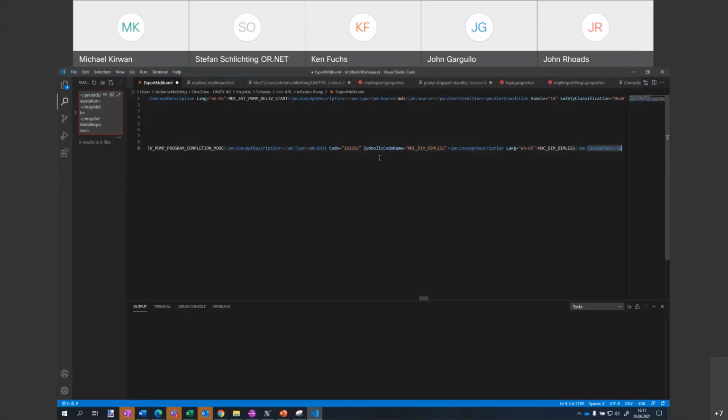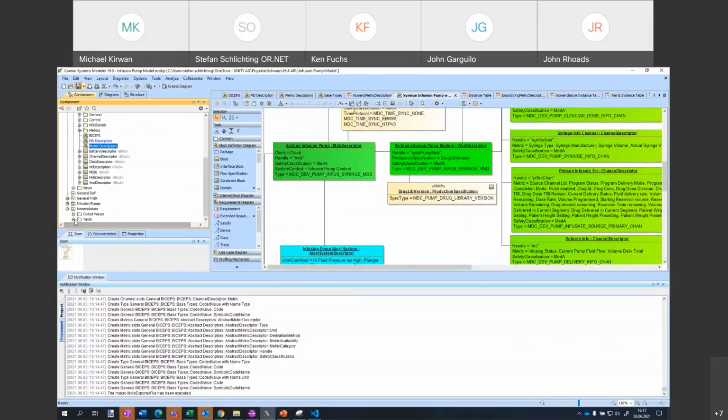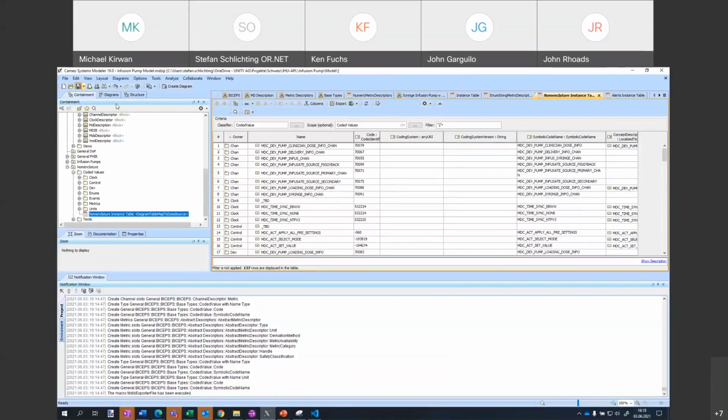Yeah, and that's it. That's the starting point for the modeling. So it has the meta model of BICEPS for the descriptors in it. Oh, what I forgot is it has, of course, nomenclature included from the 11073 10101. So it has some nomenclature codes included, for example the ref ID, and it sometimes links to text. And for that, I currently write an importer. It has the CF10 code included. Yeah, that's it. And this is what it uses to generate the model.